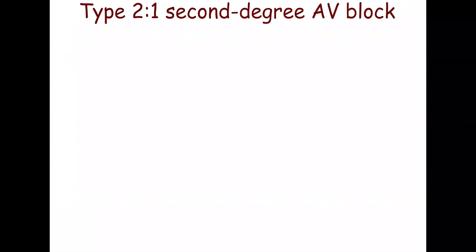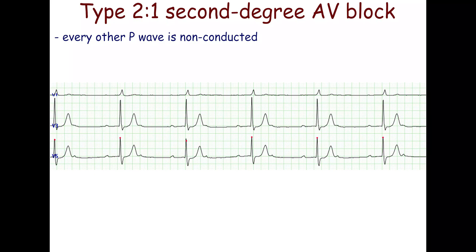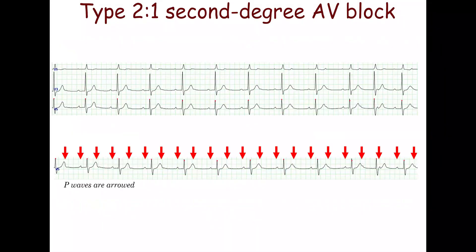The 2 to 1 type is a distinct type of second-degree atrioventricular block in which every other P wave is non-conducted. Sometimes the P wave may be completely superimposed on the T wave of the previous beat and completely invisible. This ECG may be misinterpreted as sinus bradycardia; however, a careful examination of the long strip may provide a clue to the diagnosis.